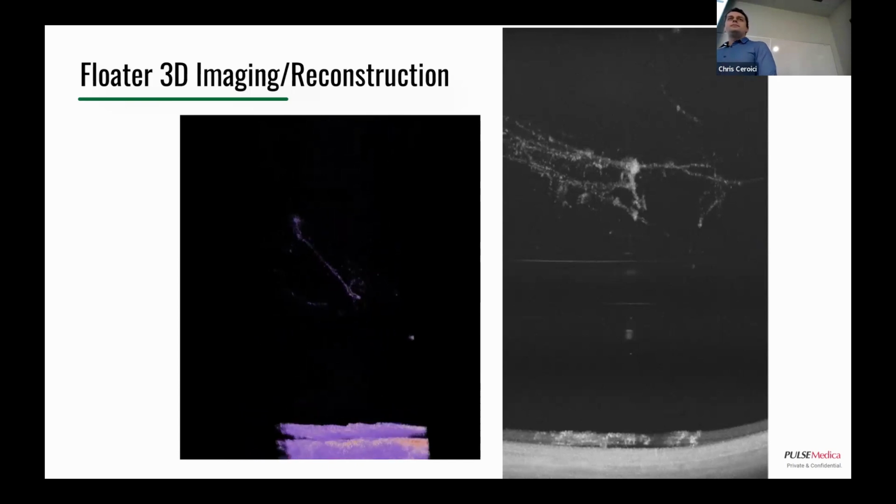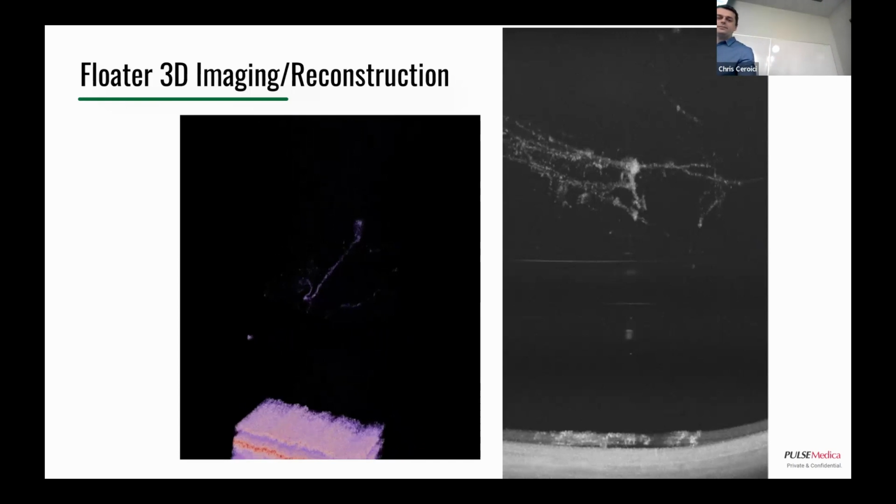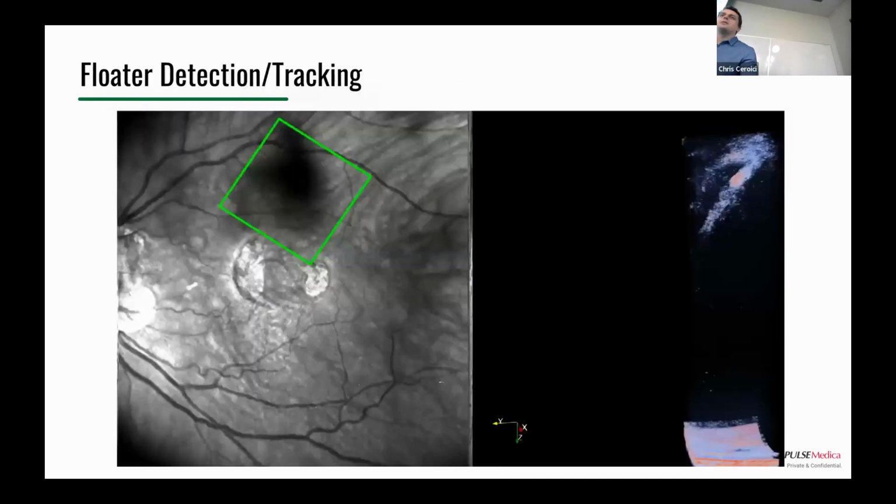Sorry, what you're reporting? Yeah, so what's actually happening here is, have you ever been to the ophthalmologist or an optometrist? Basically, you sit with your chin on the chin rest, and there's a thing in front that you look into, and usually they'll have a little target that you stare at. That's basically what this is like for the patient. So they're completely awake. They can be blinking. We try to keep their head still, but it's very non-invasive.